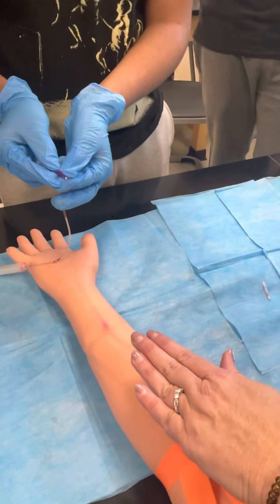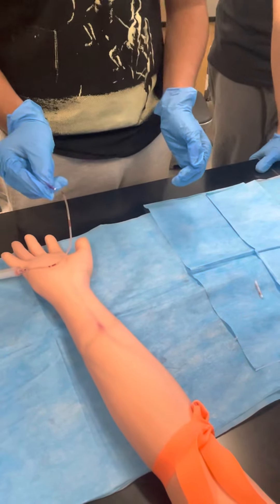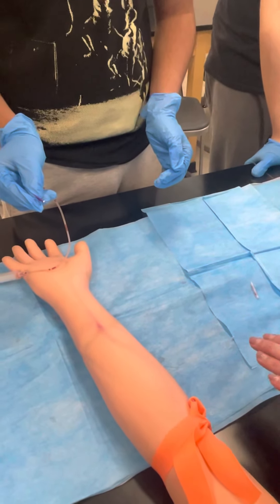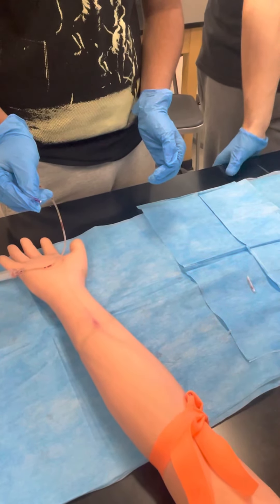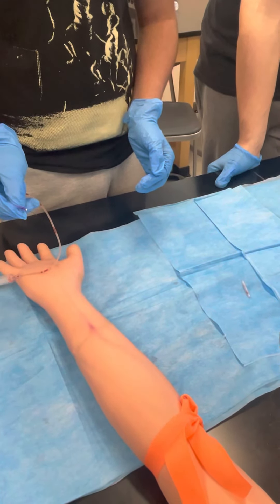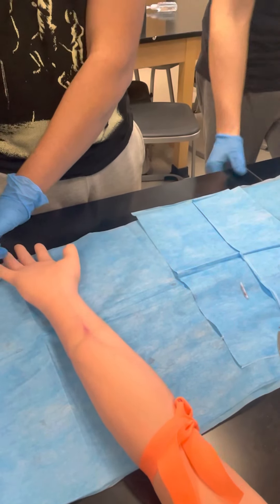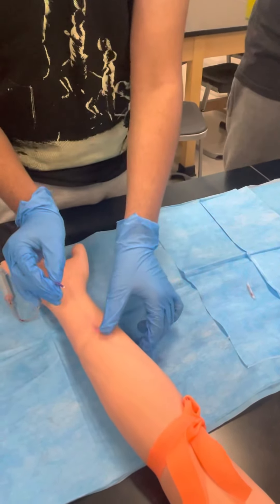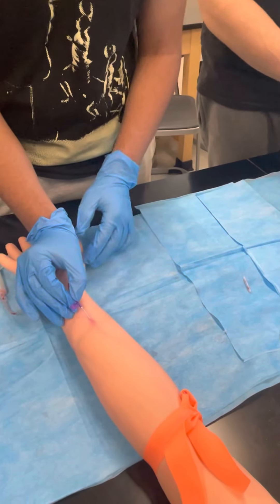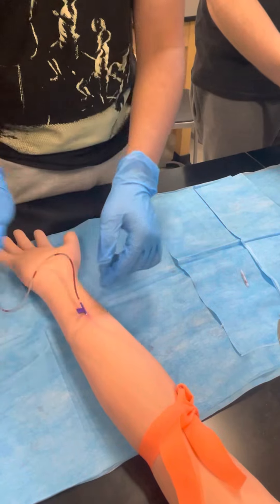Without touching that area again, you're gonna go into that vessel that you cleaned off at an angle of about 15 to 20 degrees and you'll almost feel or hear a pop. When you think you're in, draw back on your syringe and draw out the blood. Take off your cap and check for that bevel — the bevel is like the opening of your needle.